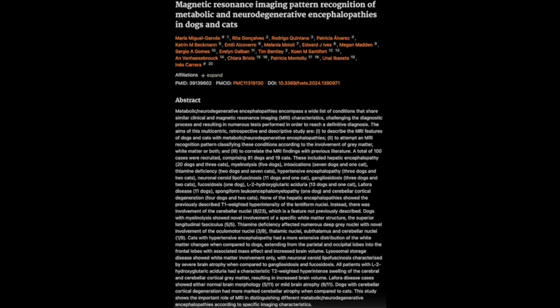It seems they didn't just rely on the MRI, right? No, they didn't. They actually confirmed all the diagnoses with additional testing. Like blood work, genetic testing, and even histopathology in some cases. So looking at the brain under a microscope. Exactly. So we know for sure that these MRI findings are tied to these specific diseases. That's a real strength of this paper. It is, because in a lot of studies, you don't have that definitive diagnosis. You're just assuming, based on what you're seeing. But in this study, they really went the extra mile.